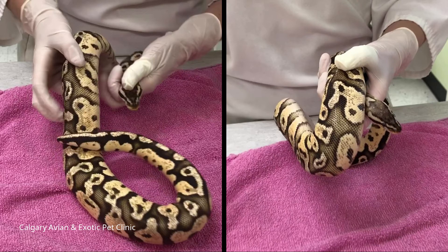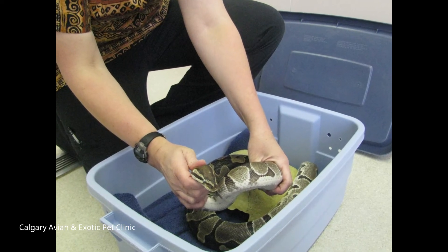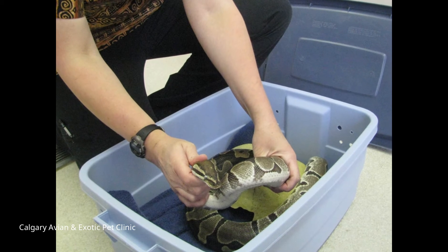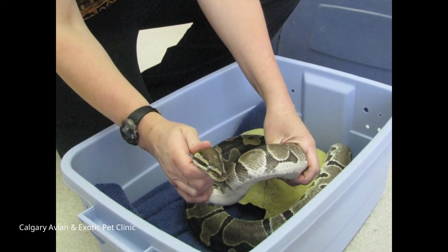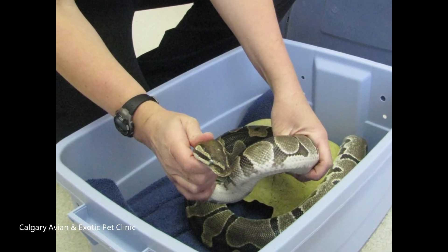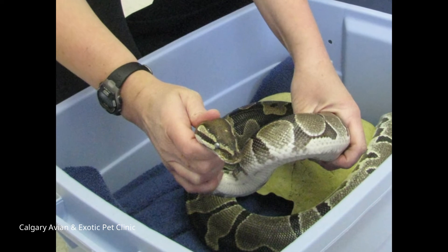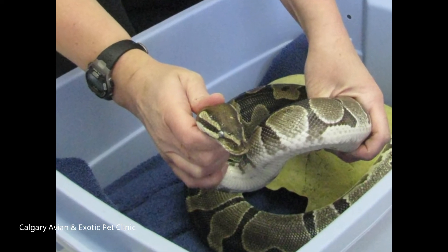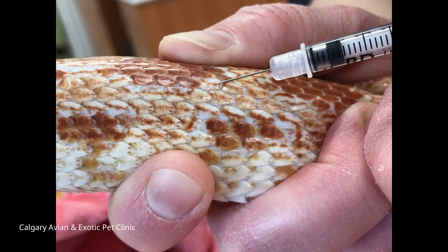To control the snake, either have a holder assist you or gently bend the front part of the snake back so that the head and neck area are supported next to the body. To aid in controlling larger snakes, place the back half of the body in a pillowcase or container. Do not pull excessively on the head, as this can result in damage to the spine. Always support the area where the head and body connect.